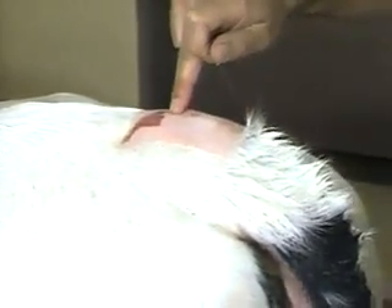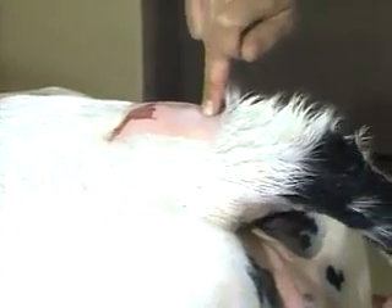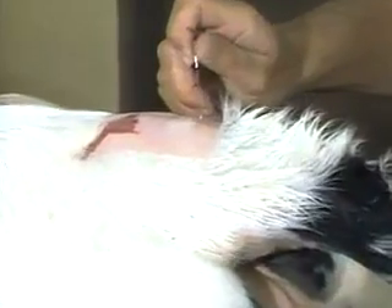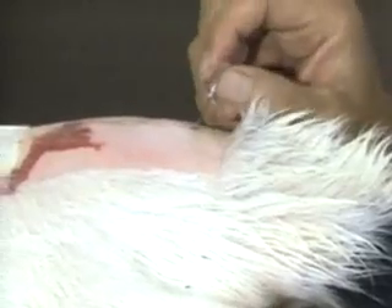The alternate site is at the next space — I'll just point out where that is. Right there is the site I entered. Here is the first coccygeal vertebra, and right there would be the second site. The needle would be thrust in right there. So here's the first one and there's the second one, to give an idea about how far apart they are.